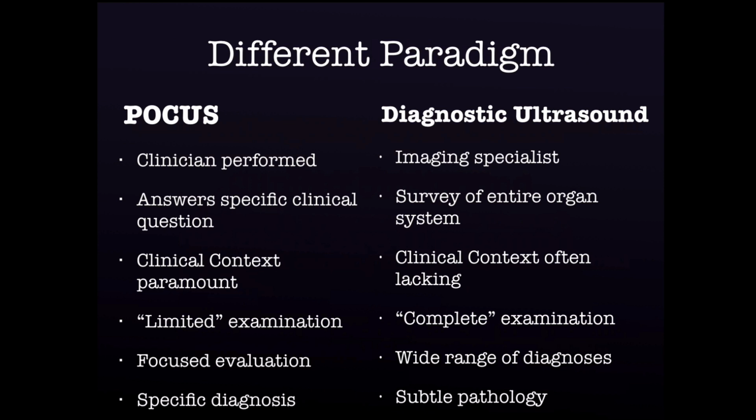Okay? So it's very different. We're looking for very focused things. So are there gallstones? Is this cholecystitis? Whereas they're looking for a wide range of diagnoses, including cancer. We never look for cancer. If we happen to find cancer, then we should follow up on it. But if we happen to miss cancer, we're not held responsible for that either, because we're not looking for subtle pathology.